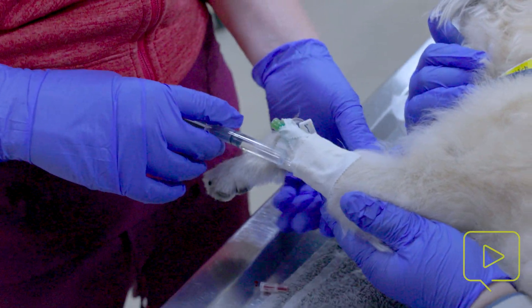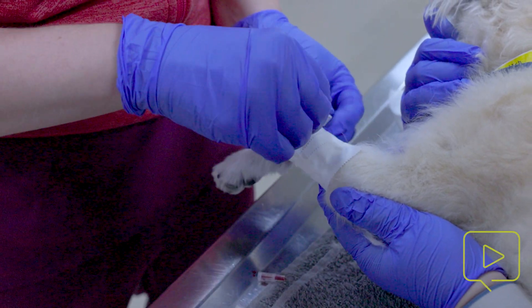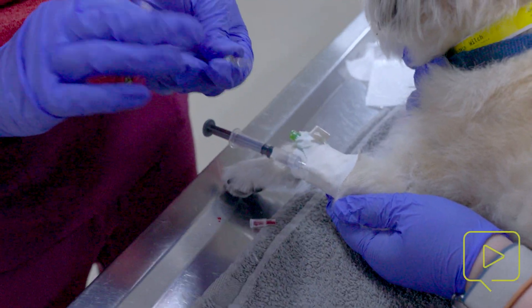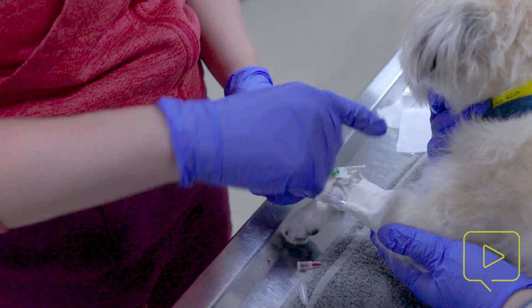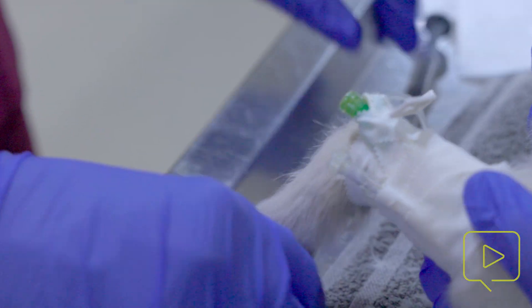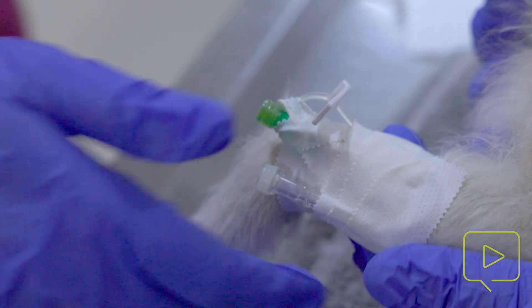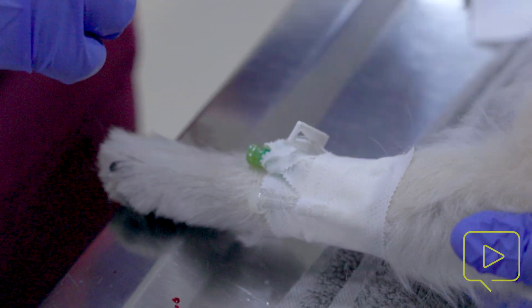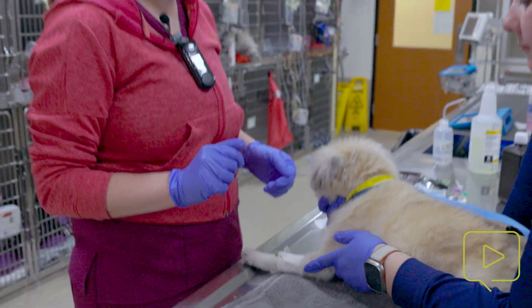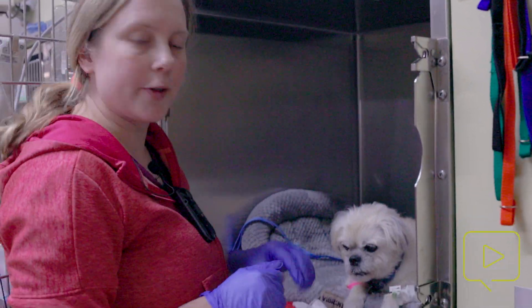The last thing I'm going to do is flush one more time to make sure nothing crazy happened. It feels good, so I'm going to clamp the IV catheter. I'm going to get a new maladapter, separate the pieces, take this piece, insert it into the end here. Since I clamped it, I'm okay to remove my syringe and put this on. And then you have the catheter taped in. I also try to wear gloves for all of our patients when I can — in emergent situations it's not always easy, especially if it gets bloody, but for most patients you want to try to wear gloves to keep it as clean as possible. Next, we're going to be hooking up the fluids.